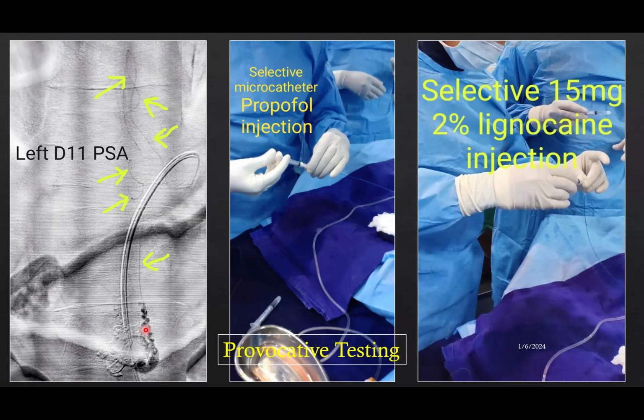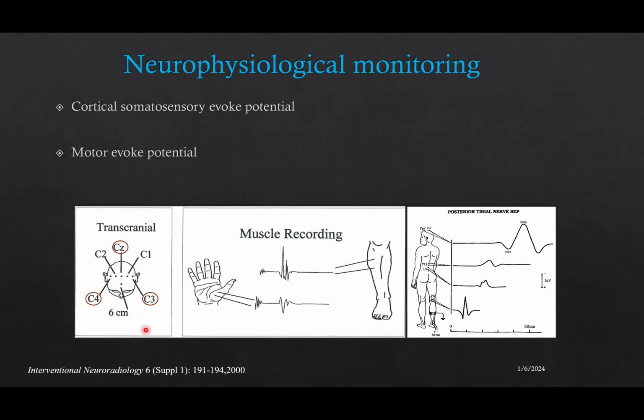For motor evoked potential, the electrodes are placed over the scalp, through which the electric potentials are passed, and then the signals are received at the limbs, the organ which we want to look at. Like if you are looking for potentials from the lower limbs or upper limbs. In the same way, for sensory evoked potential, the electrodes are placed on the distal limbs, and the potentials are received from the scalp electrodes placed on the scalp.